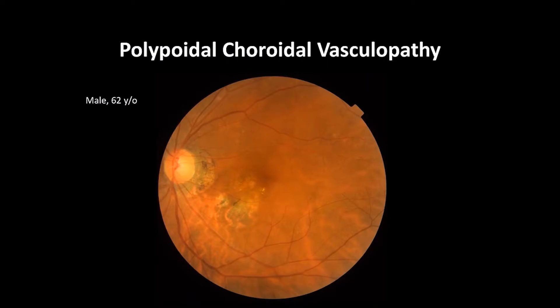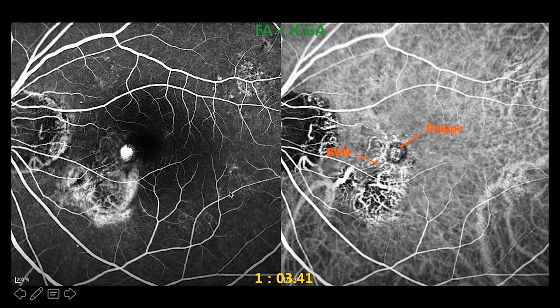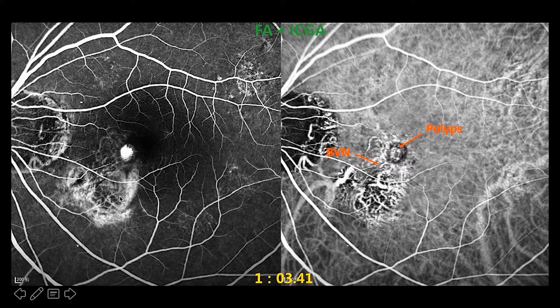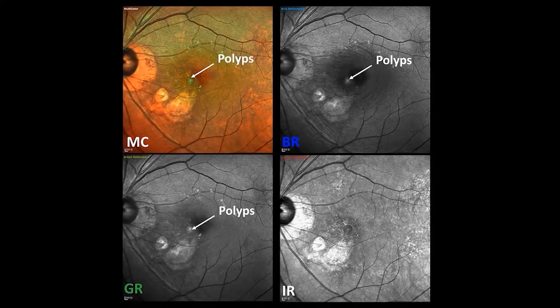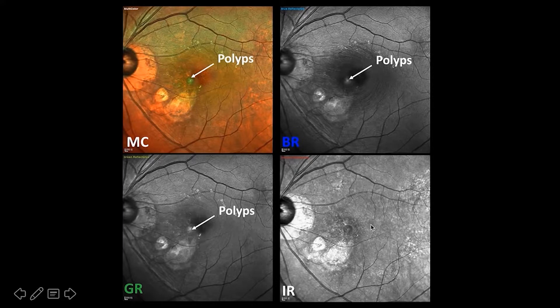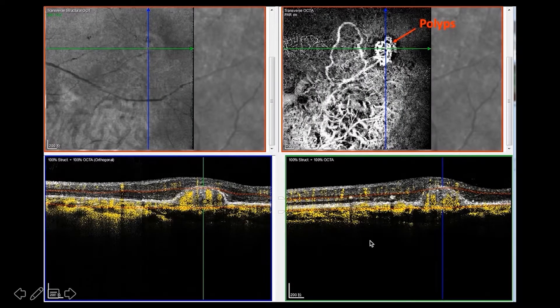Here comes a case of polypoidal choroidal vasculopathy. The lesion can be seen in this area on color fundus photo. ICGA and FA confirm that there are polypoidal lesions and abnormal branch vascular network, which all showed up on OCT as well. Polyps can be seen on blue, green, and multicolor images. BVN and RPE changes showed up well on infrared reflectance. OCT angiography also discovered the polyps and BVN nicely. Multicolor imaging combining with OCTA and ICGA can fully detect the pathology of PCV.